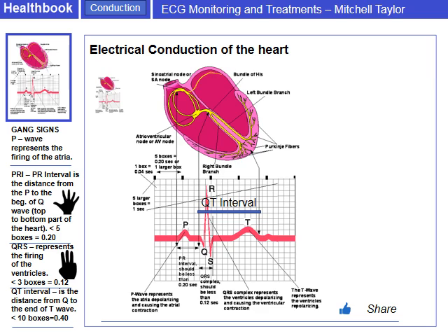That's right, the QRS complex is the most important, because that represents the depolarization of the ventricles. You lose the atria, you lose about 15% of your cardiac output. You lose the ventricles, you lose 85% of your cardiac output. So which am I going to choose here? I'm going to choose the, that's right, 85%. Right, good, the ventricles. Good job.